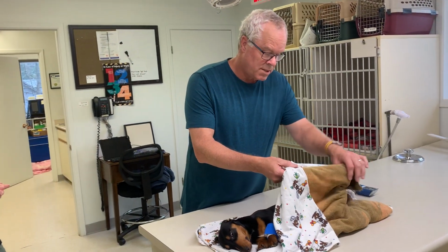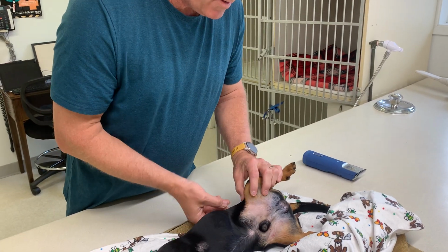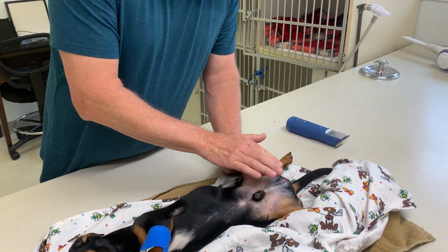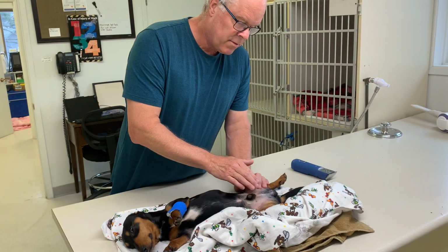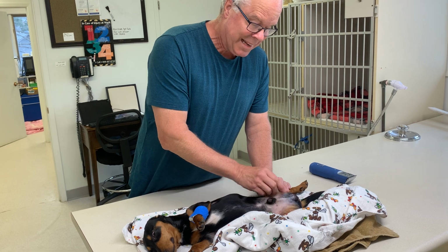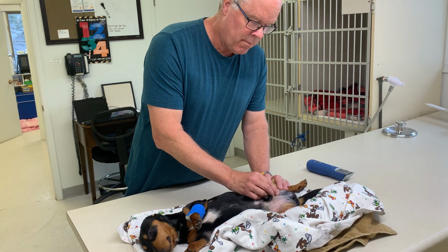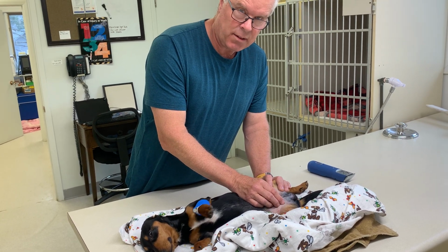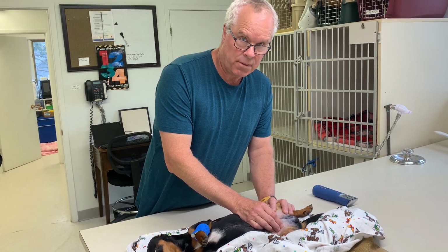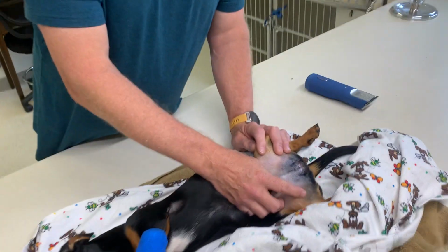I am. One of the risks of clipping a dog this small to do this surgery is that it's very, very easy to irritate this skin. It's very thin, and the heat from the clippers very quickly can cause clipper burn. In this location, I prefer to see less hair clipped and a surgical prep performed than being overly aggressive and making sure you get every little hair shaft out of there, and this dog is bald. You will have more post-op complications afterwards with that. It is not necessary. So I like this clip, I'm happy with it, and I wouldn't want it clipped anymore.